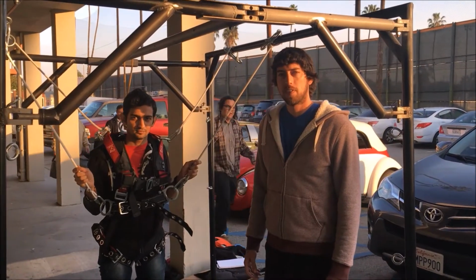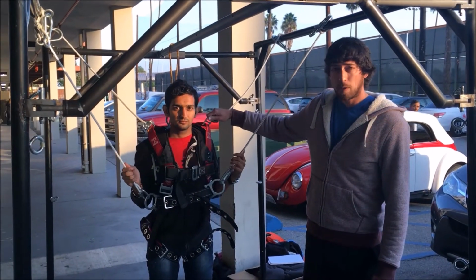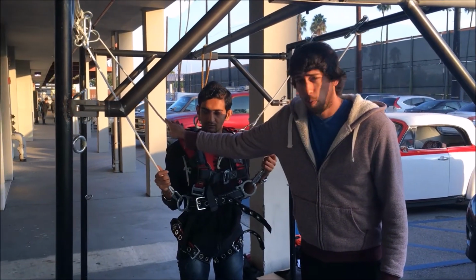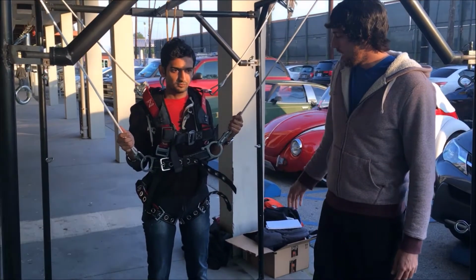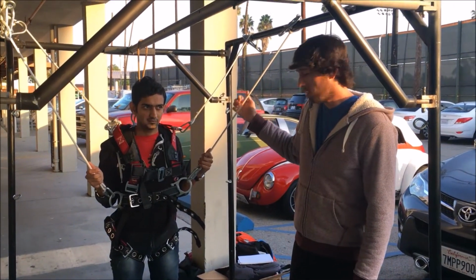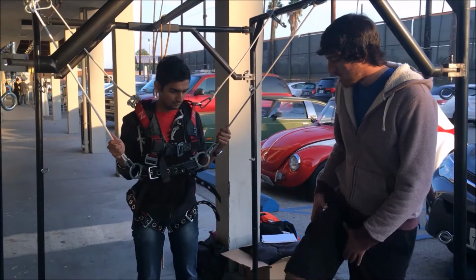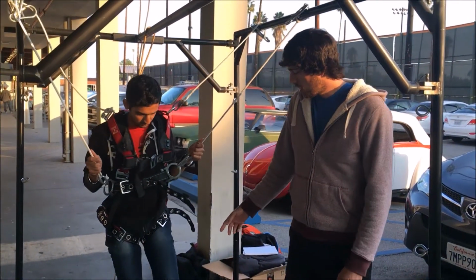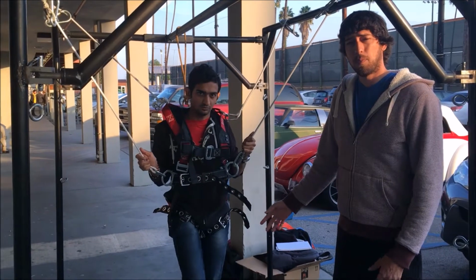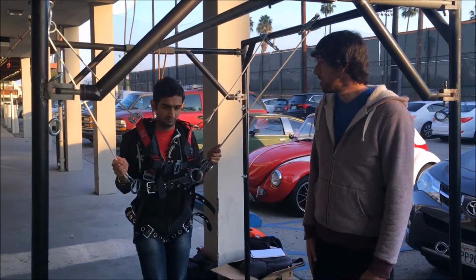So the key features of this harness include that it has rings up in the shoulders that are away from the patient's head, has rings on the side of the waist so you can connect other bungees and other supports, and that it has mobility in the legs. As you can see, he has plenty of range of movement, and this will help when he's walking. He'll have that flexibility and ability to move.